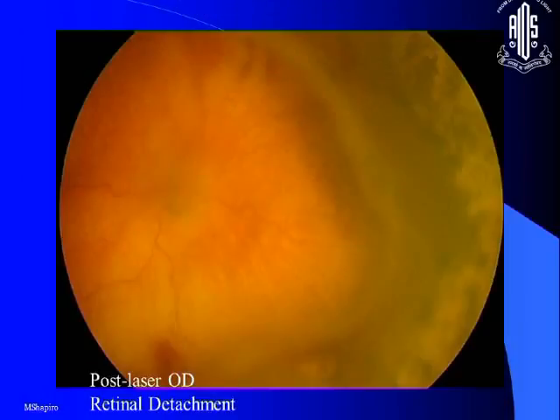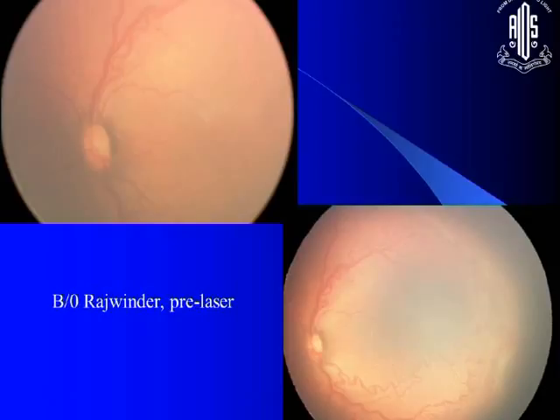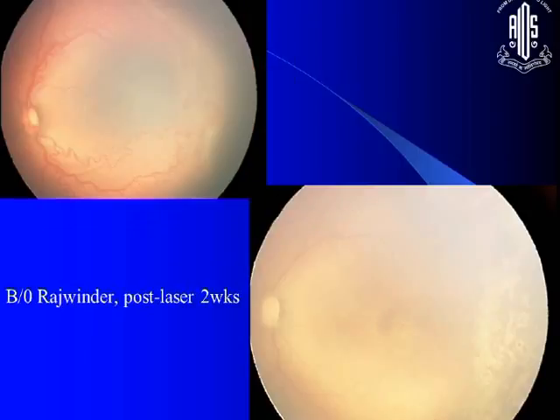And one of the other cases where there is already a 4A retinal detachment which has developed. So this is from our collection later on, once we got the RetCam. You have this baby here, and you can see how much plus disease is there, dilatation, tortuosity, and that is what you want to see. Now look at this, just after 2 weeks, these vessels have straightened up. There is no dilatation, tortuosity. So that is what you gain, and that's what you would like to see.